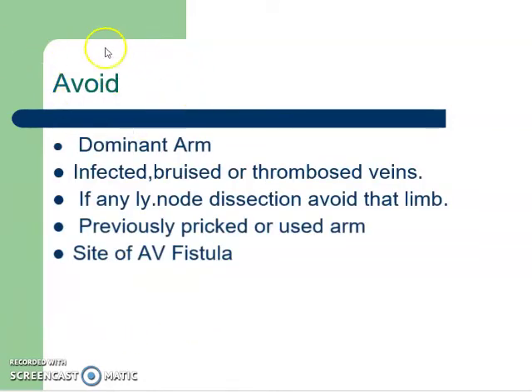Now, what are the things you should take into consideration while cannulating, selecting the site or the arm to cannulate? First and foremost, don't select the dominant arm.